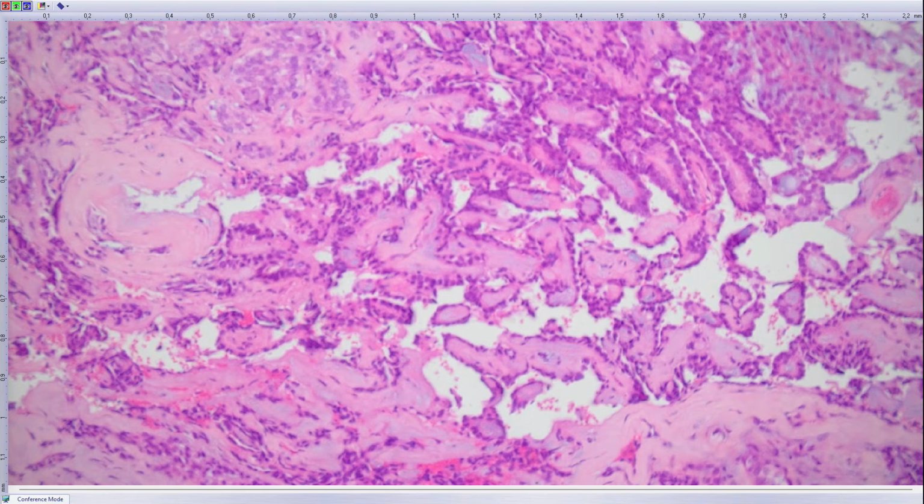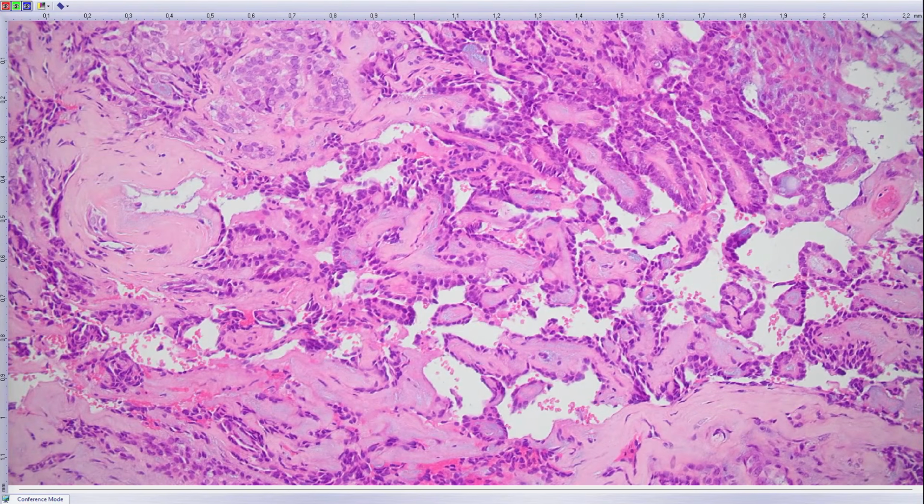I even did whole research everywhere, and we found that if some group published a series of polymorphous low-grade adenocarcinoma with, let's say, 5% metastatic foci, they were usually on the tongue, and it is very well known that 70% of these cribriform carcinomas that you now view are present on the tongue, so we think that they merge 2 different entities together, and this is the one that metastasizes.